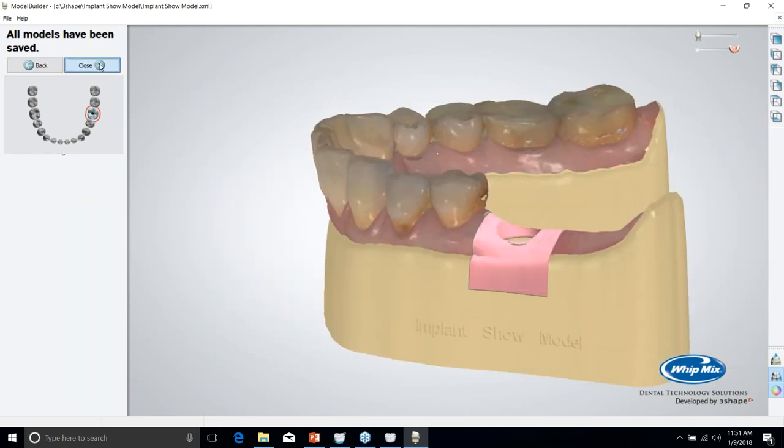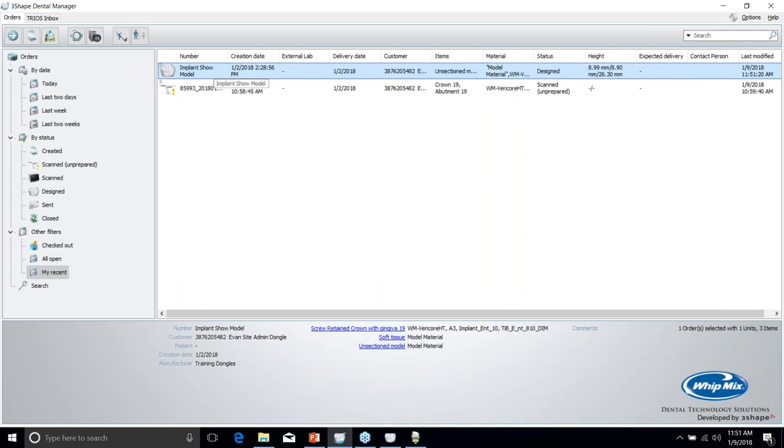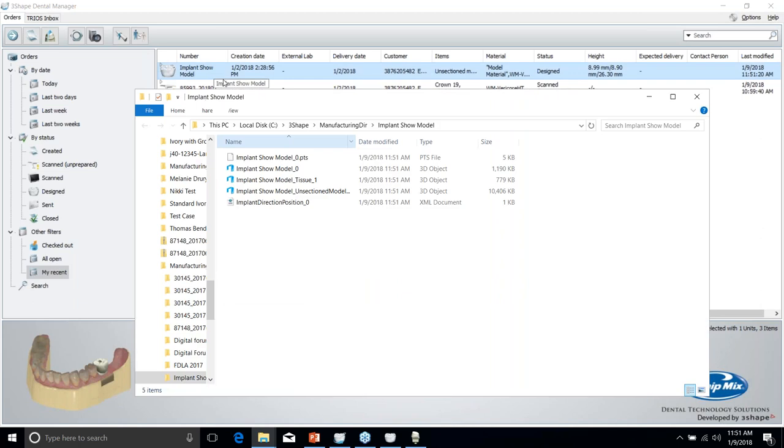So that's the final model. Just close. And then to get your STLs, you select your case, hit F7 on the keyboard, and then Shift F4 will take you to your output directory. So you'll get your zirconia.